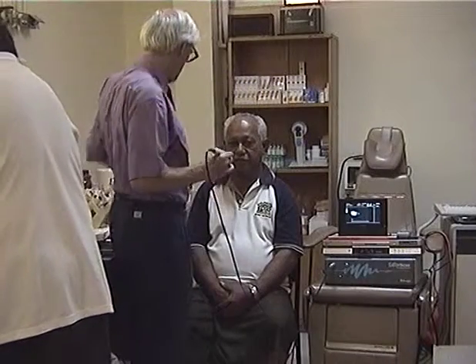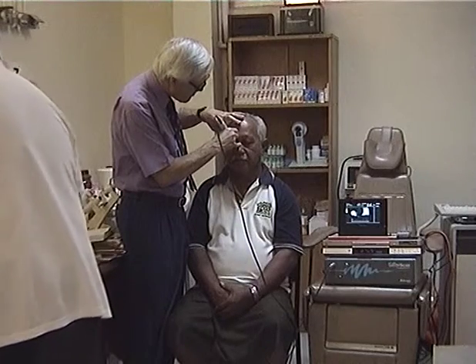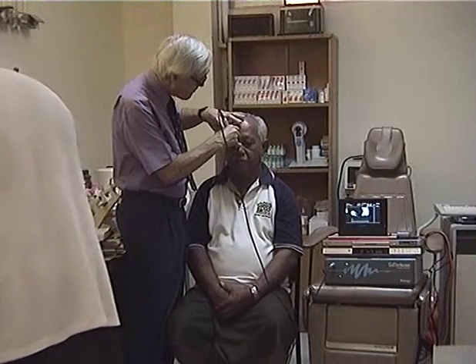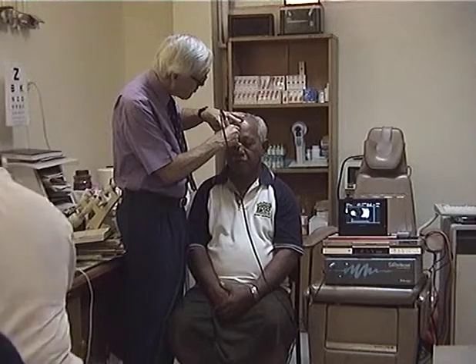This reduced the equipment to manageable proportions, and back in Samoa this proved very useful. You can see it set up on the dental chair on the left-hand side of the patient.